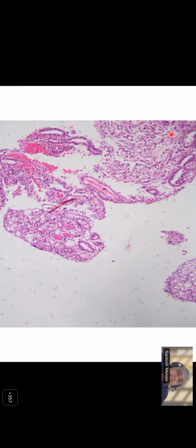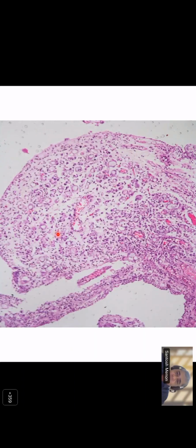So Niharika, you were saying that there are blood vessels. So you think these are capillary-sized blood vessels? What about these ones? Glands or tubules or whatever you might want to call them. So there is something here in the subepithelium. What about this section?